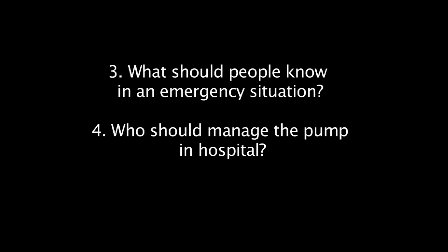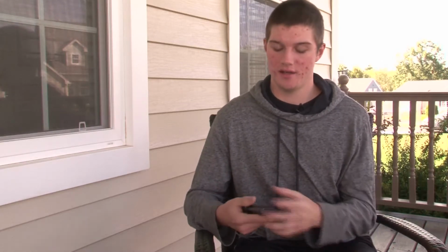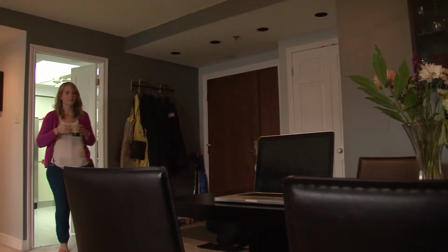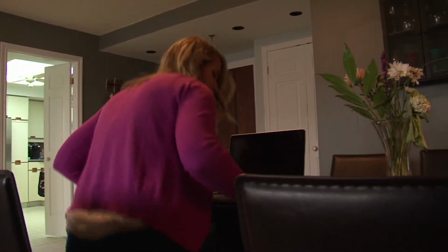If I was in an ambulance or if it was the emergency room, I just want them to know about, obviously, low blood sugar and high blood sugar, and say my blood sugar was high, to maybe give a little bit of insulin to correct the sugar, or if I was low, to disconnect it to make sure that I wouldn't go any lower. I'd expect to, if capable, take part in my management. I mean, I understand that the healthcare team at the hospital would want to be involved with my management to make sure that they know what's going on as well.